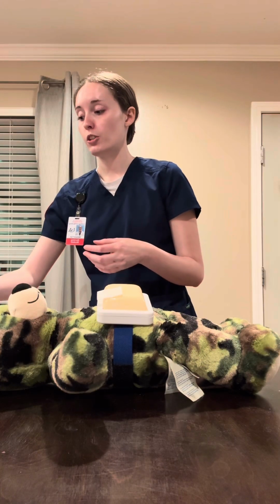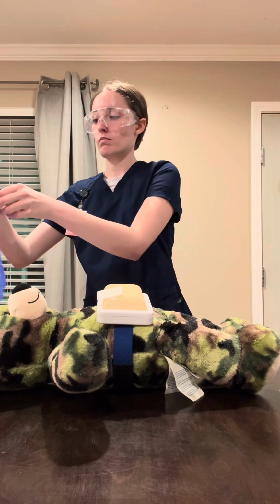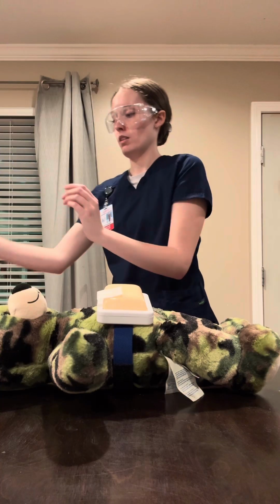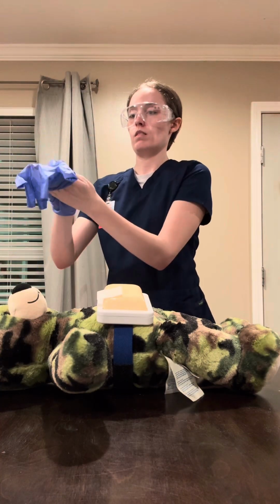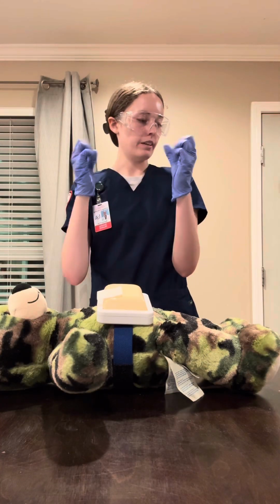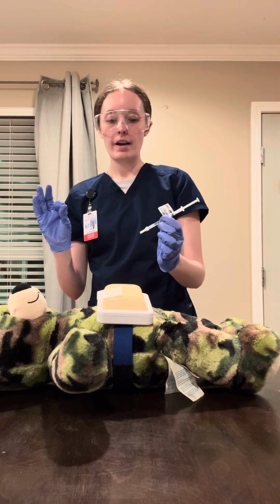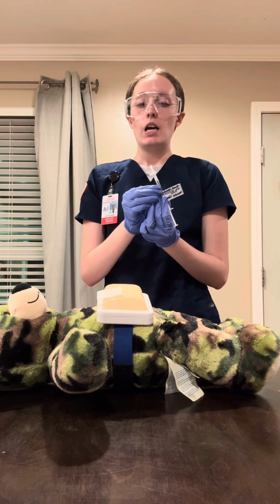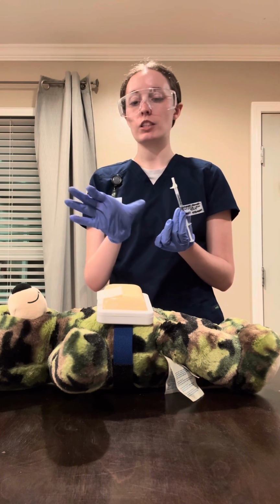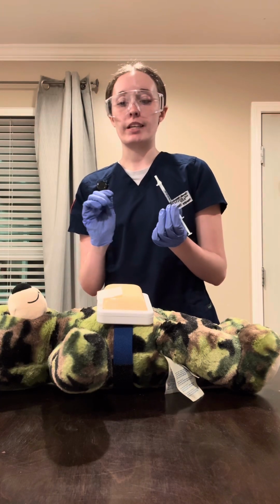So now I'm just going to apply my goggles, and then my gloves. Okay, so I have everything. Now, Mr. Jones, since I'm going to give this shot in the abdomen, I'm going to squeeze. It looks like I can squeeze around 2 inches of skin. So that means I'm going to insert this at a 90-degree angle, okay?